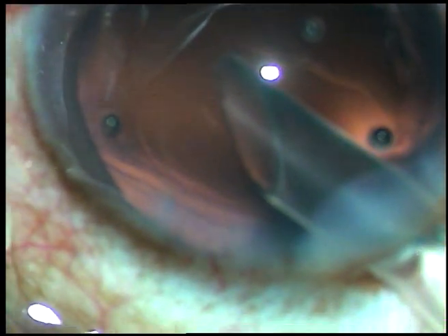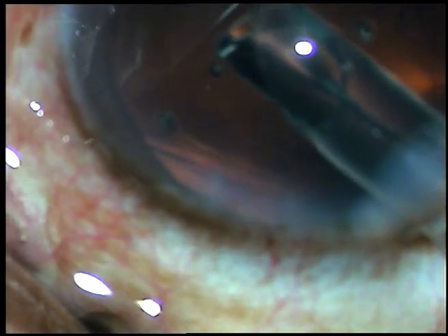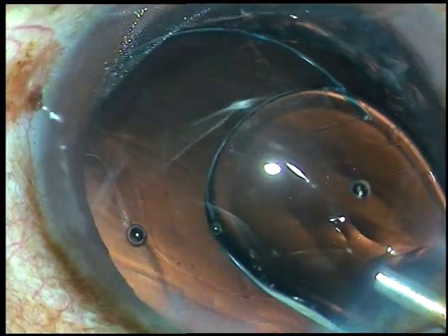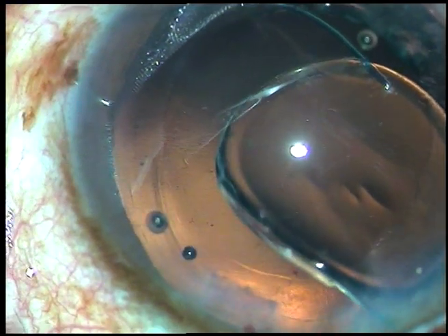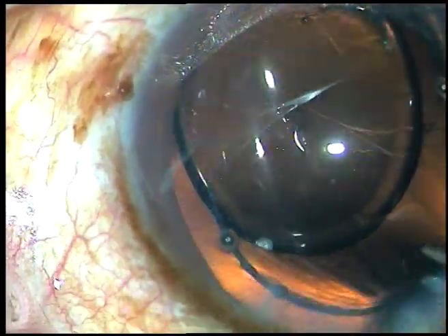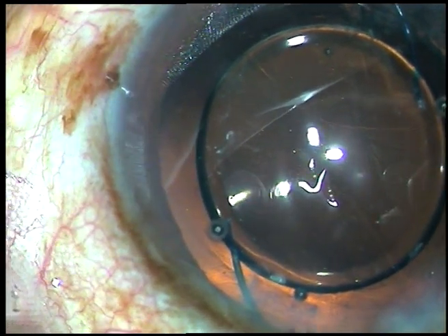And now I am going to implant a multi-piece, three-piece intraocular lens in the bag. The leading haptic has gone into the bag. Now I inject some viscoat over the optic. I take a McPherson's forceps, hold the trailing haptic, and place the trailing haptic in the capsular bag.